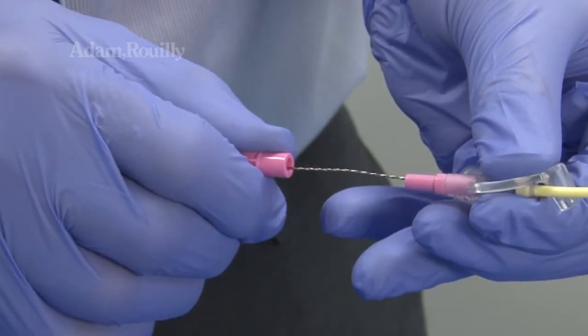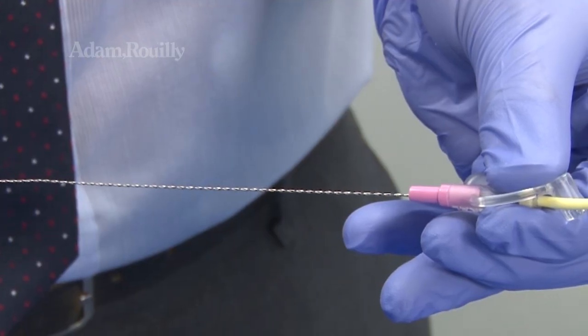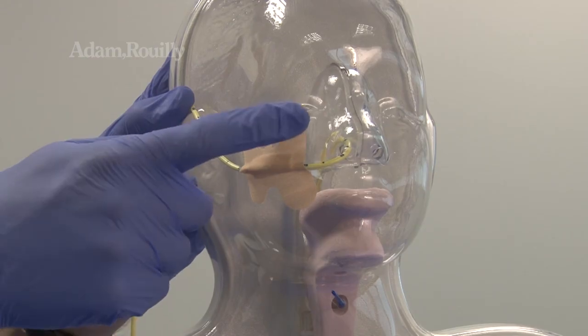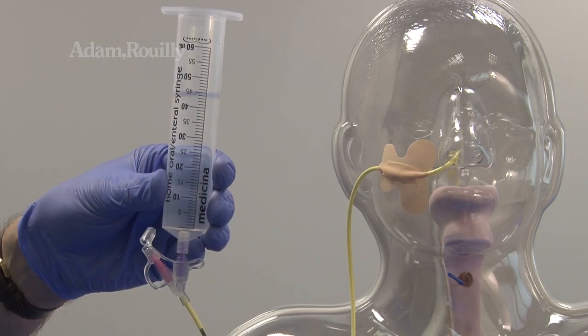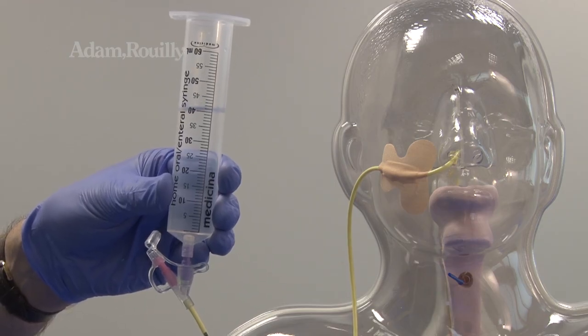Guidewire removal can also be performed, and adhesive dressings can also be applied to the model. Administering of liquid, feed or medication via bolus or pump can be simulated.